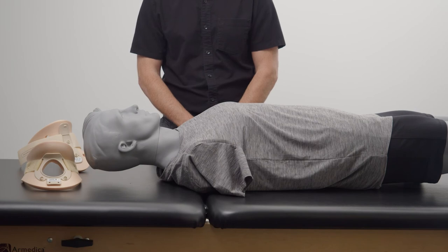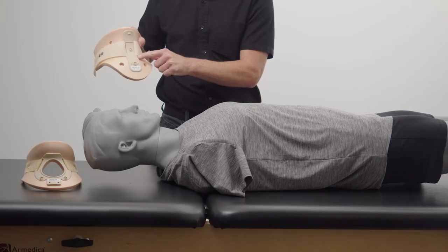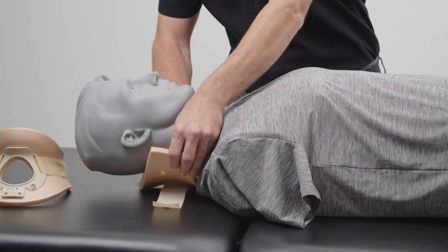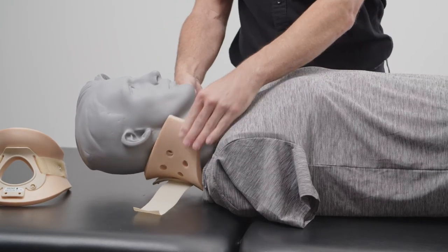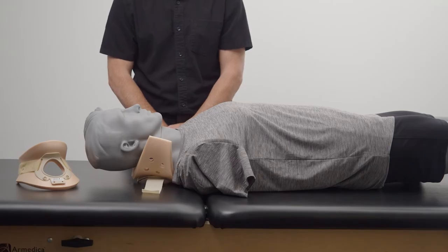Now that we know the correct size for the initial fit, we can begin by sliding the back piece behind the patient's neck and centering it, noting the arrow on the back panel is up. Please note, long hair should be placed outside of the back piece.